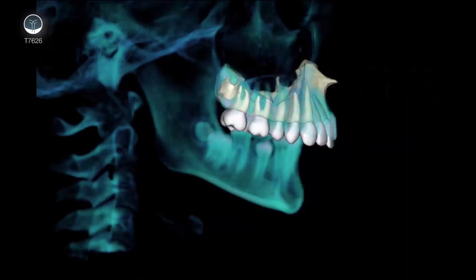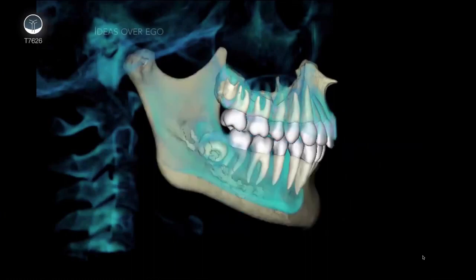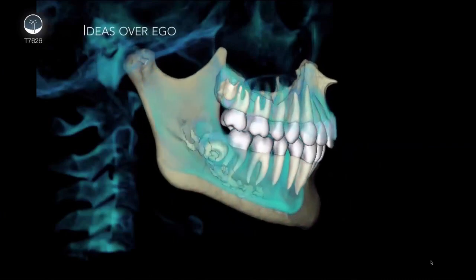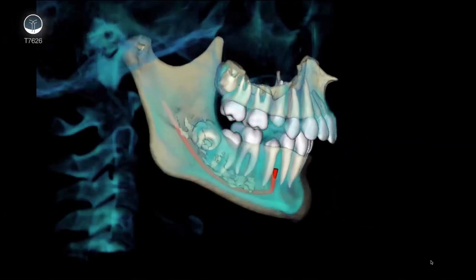What is the take-home message regarding CBCT? Well, it's what you can do with the technology that's so important. It's the ability to properly diagnose and to treatment plan the case. It's the ability to look at the alveolar housing, which I would say ultimately dictates your treatment options and determines your treatment plan.